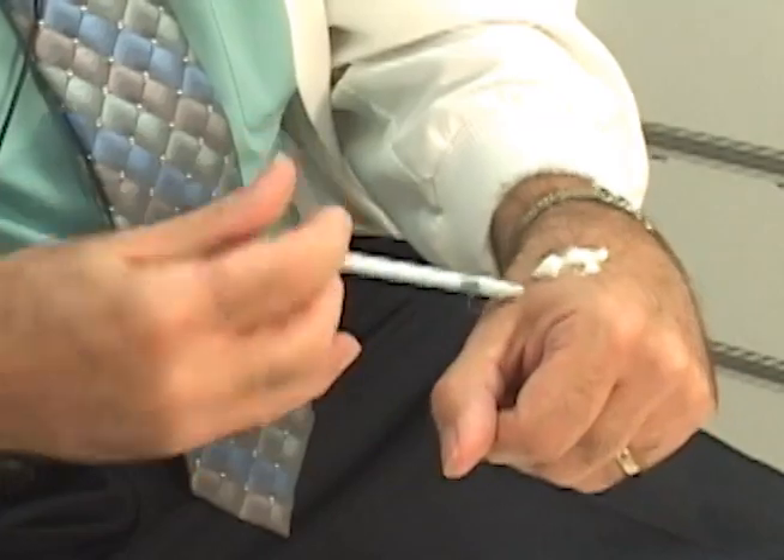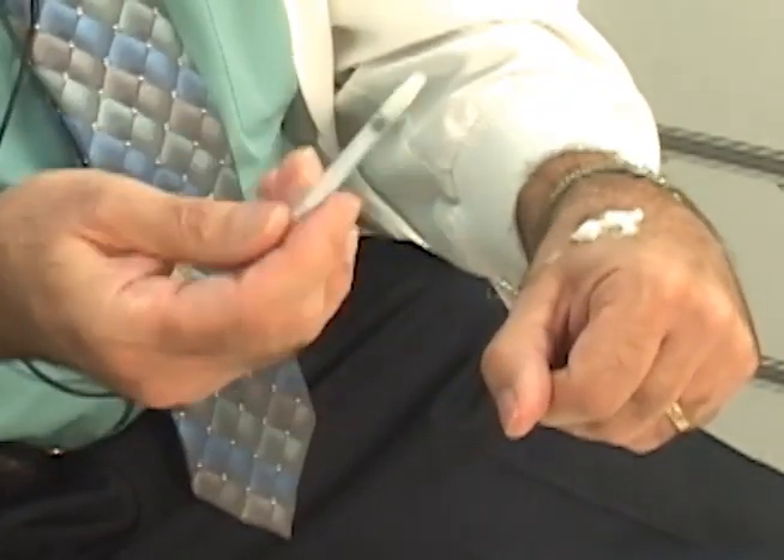That could be 1 ml or could be any portion of 1 ml — 0.5, 0.1.